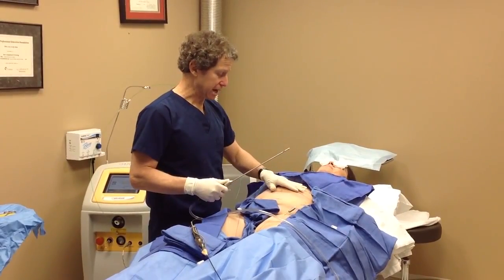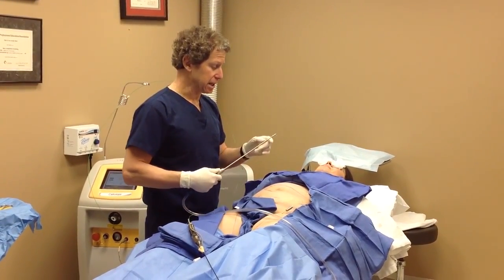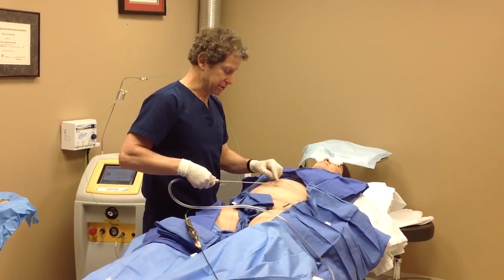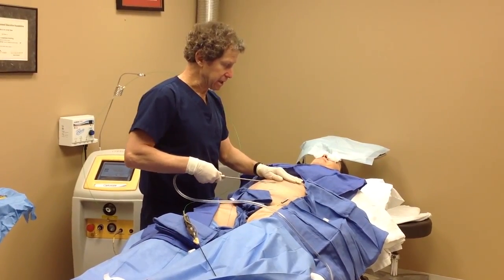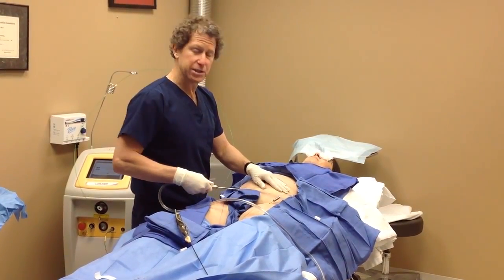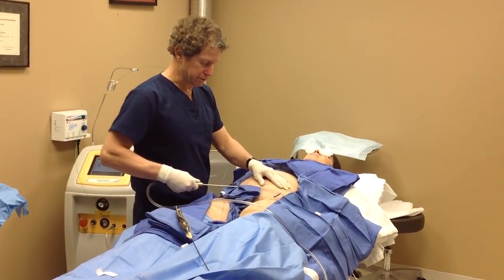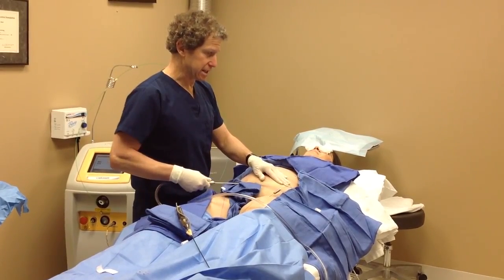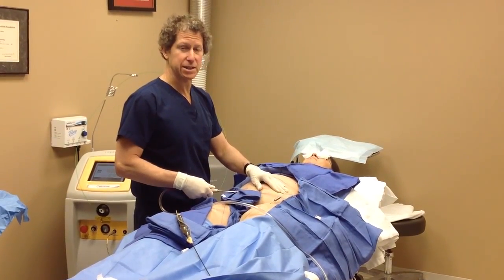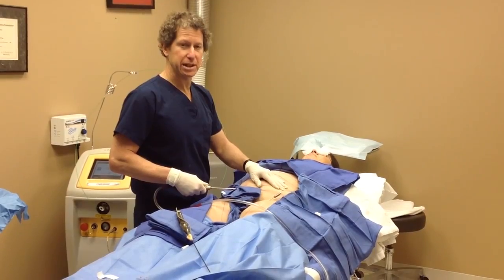I've lasered her abdomen, melted the fat, and heated up the skin. Now I'm introducing the liposuction cannula — it's blunt-tipped, so it's very safe, with three little holes. I go through the incisions I've made, slip it in, and it goes back and forth quite gently. I know there are some videos out there that make it look rough and harsh, but there's absolutely no reason for that — you can just go gently back and forth, and it'll suck up the fat. After this, we'll close the holes with a tiny suture and Steri-Strip, she'll put Spanx on, and she can go back to work the next day.